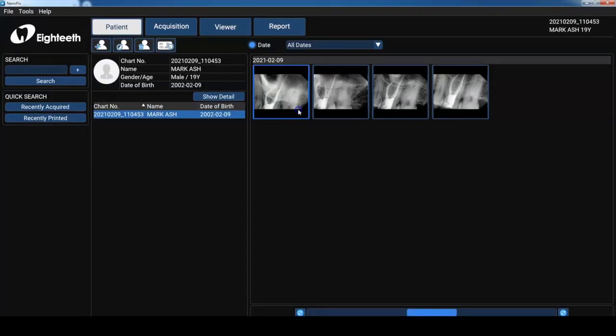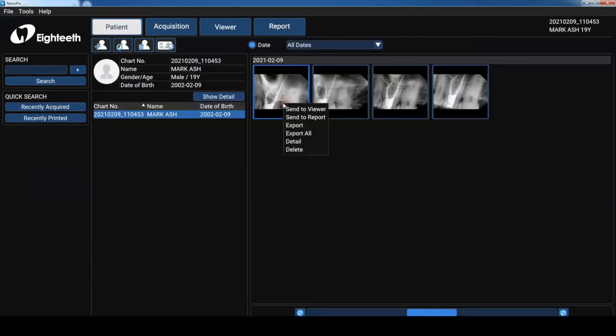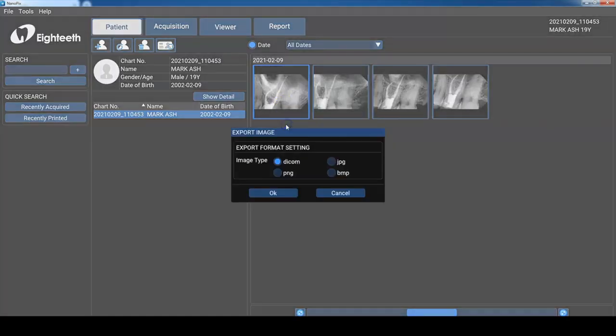Now if you double click on the thumbnail in the screen as you see it, it's going to open the image into the viewer where you can manipulate the image. If you right click on one of those images there's a number of tasks you can complete as well.